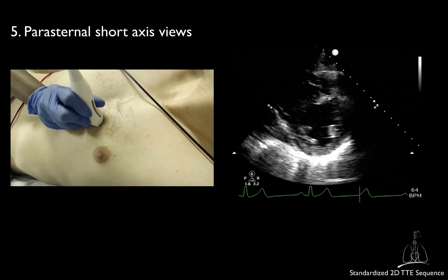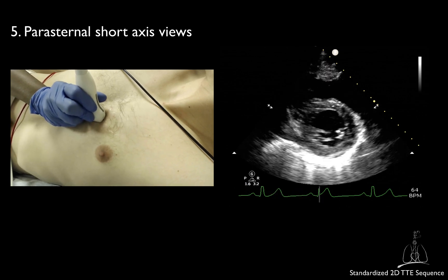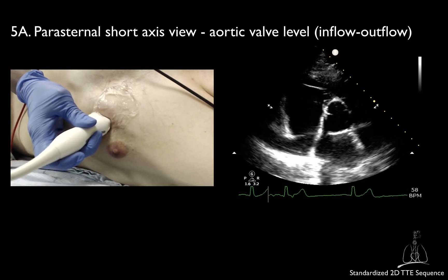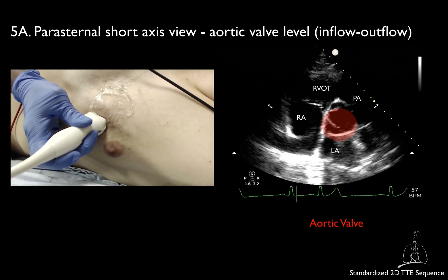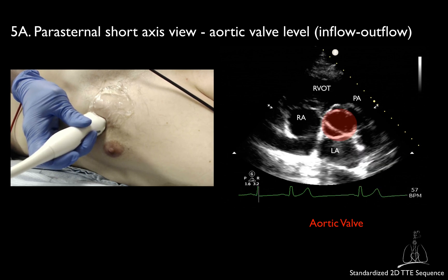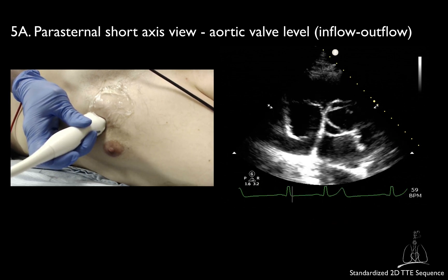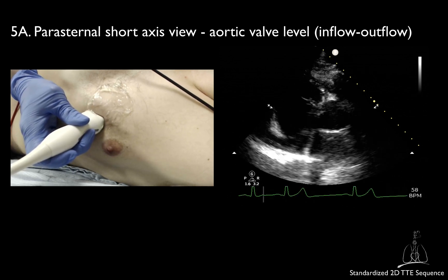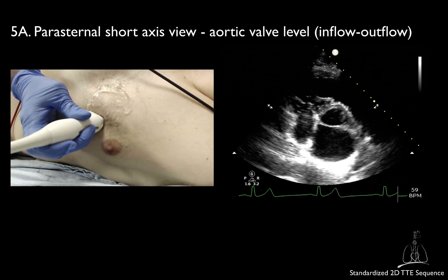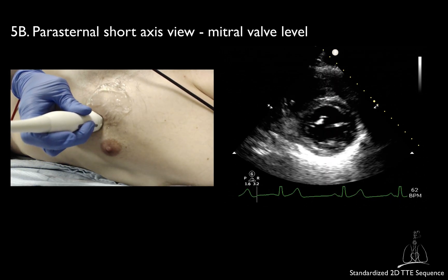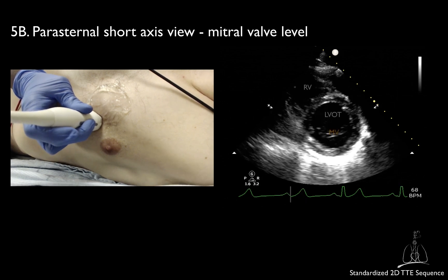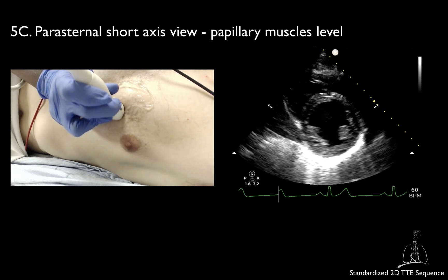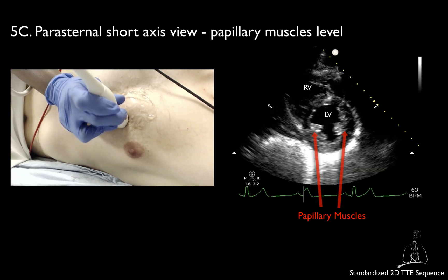You will obtain several images of the heart in its short axis at different levels. Usually we start at the level of the aortic valve — this view is also called the right ventricular inflow-outflow view. By tilting the transducer's tail slightly toward the right shoulder, you will obtain more apical views: the parasternal short axis view at the level of the mitral valve, and the parasternal short axis view at the papillary muscle level, also called the midpapillary view.